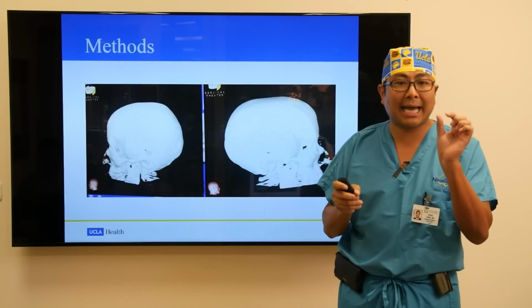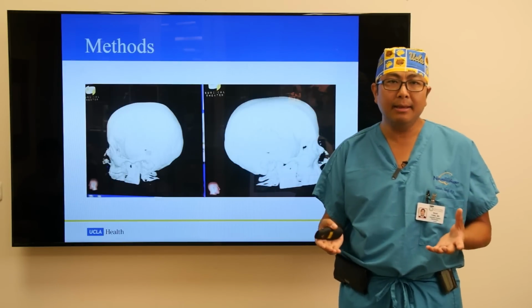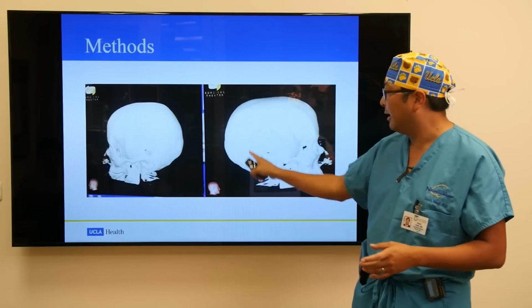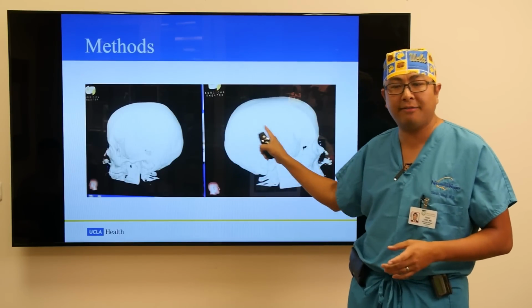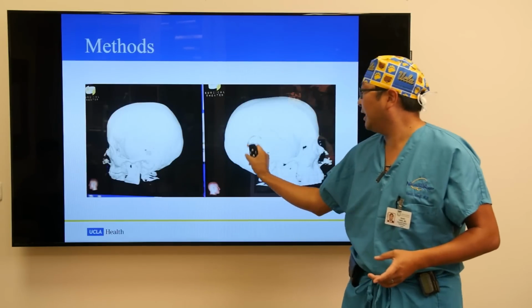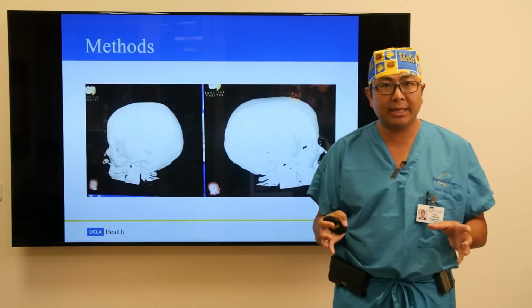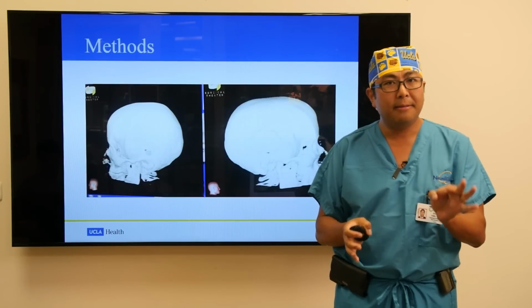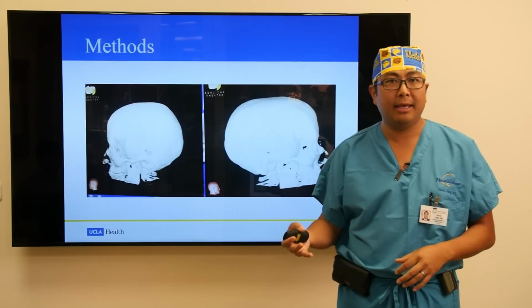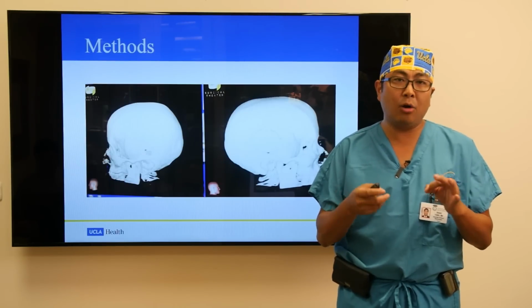And so through this tiny hole, if you look at this hole, it's about 75% smaller than the overall surface area of this. You can see that this is the old surface area, and if you took this, it would roughly be about a quarter of its old size. And so we are doing this through a hole in the skull that's about 75% smaller than it used to be. It's very, very small and minimally invasive, making a hole in the bone.